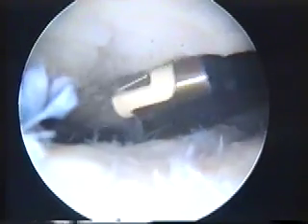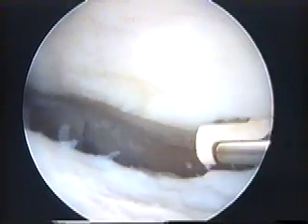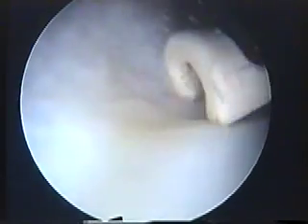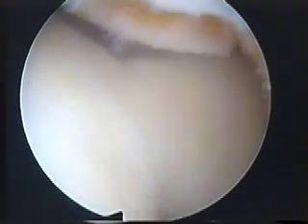Obviously, now that I've removed all this tissue, the profile or shape of the patella is not the same as it was before it was damaged. It's important to rest these surfaces over the next few weeks to allow them to recover before gently increasing the loading. You can see quite clearly there the tide mark between the damaged tissue and the normal tissue below. There's the patella going in and out of the groove — this damage is all along the inner side of the patella mechanism.